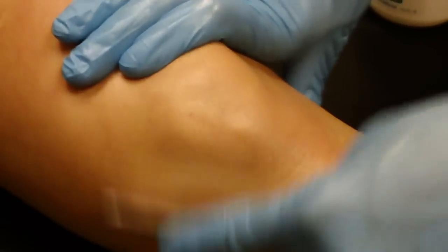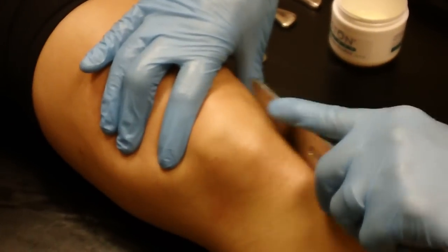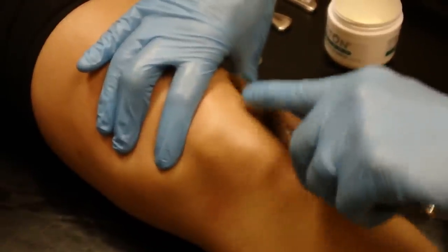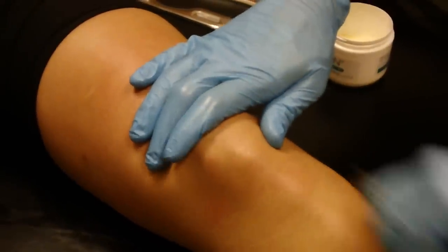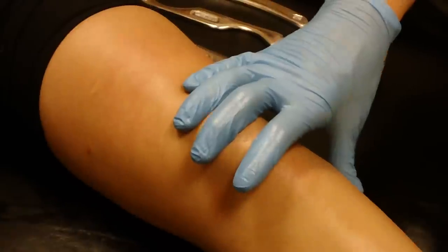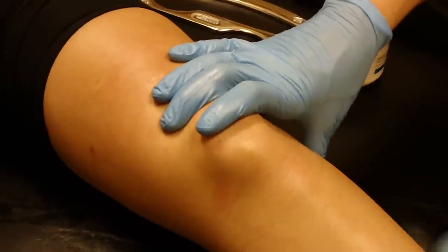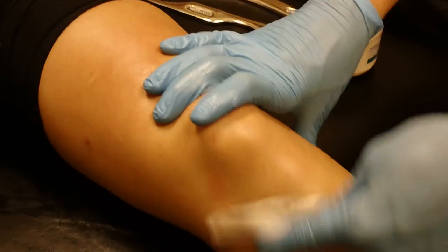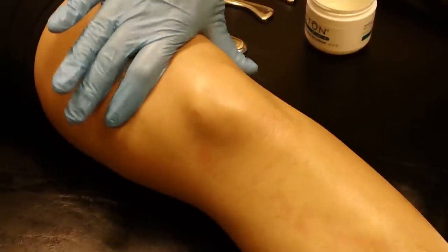Framing around the kneecap is really important. Sometimes I use long fanning strokes, sometimes real short and focused strokes in there. The knee doesn't work by itself, so working on the lower leg and the front and back part of the knee is going to be really important. But for the purposes of this video, I just want to demonstrate some of the strokes and techniques that we like to use.